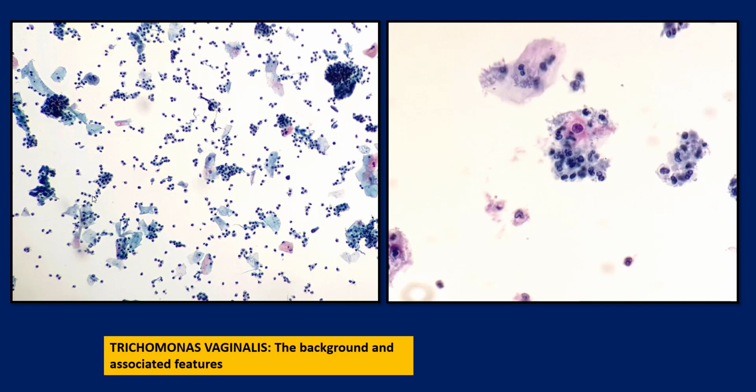neutrophil balls, also called polyballs, or polymorphonucleocyte balls, and they're adherent to the epithelial cells. The epithelial cells tend to break up, and there is also a bit of vacuolation around the nuclei, but not to the extent that we are going to start thinking in terms of koilocytosis.